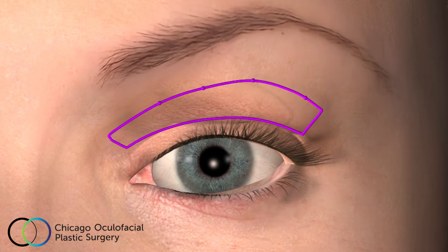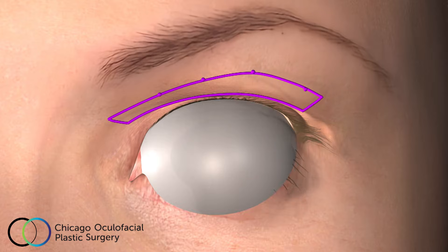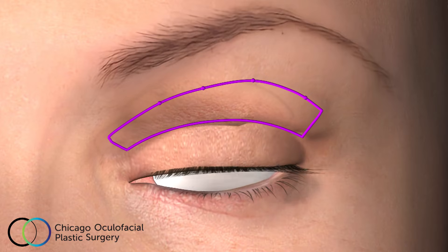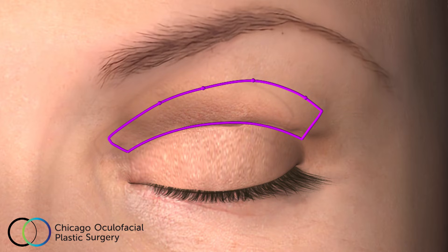Once your eyelids have been carefully marked, laser protective eye shields covered in lubricant will be placed under your eyelids. At this point, the eyelid skin will be anesthetized with an injection under the skin to ensure your comfort.